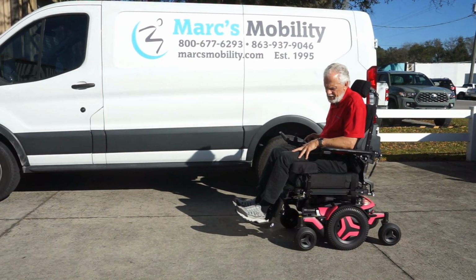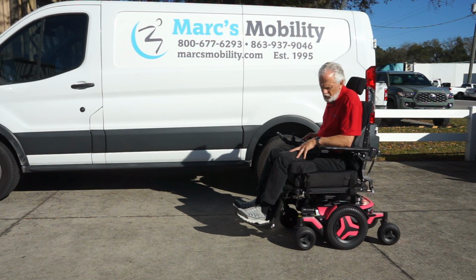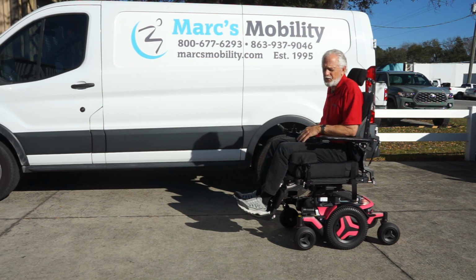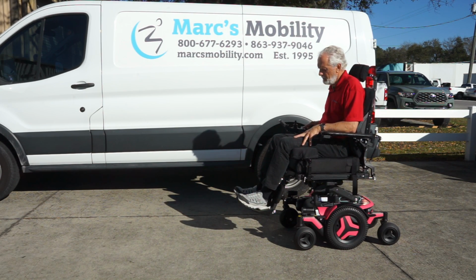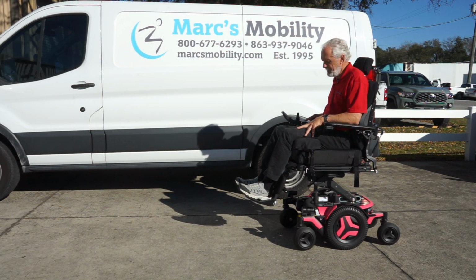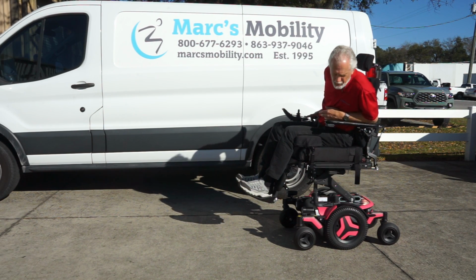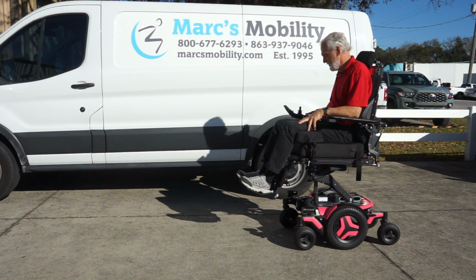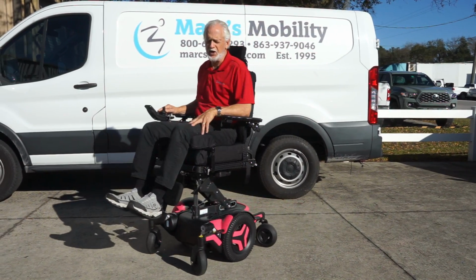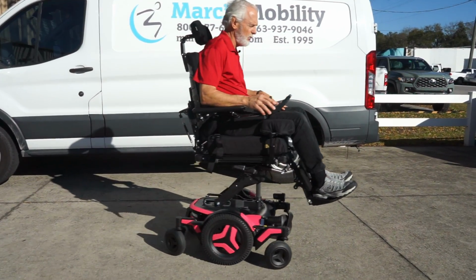I'm going to elevate the seat. So if you're going to use the seat lift on this chair, folks, make sure you're on a flat surface. It'll make your chair last longer. So I think we're all the way up. No, we're still going up. There we go. So this is what it would look like with your seat elevated in your kitchen or outside walking with someone.